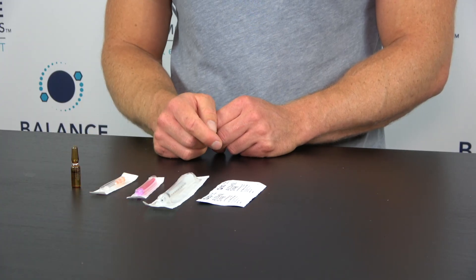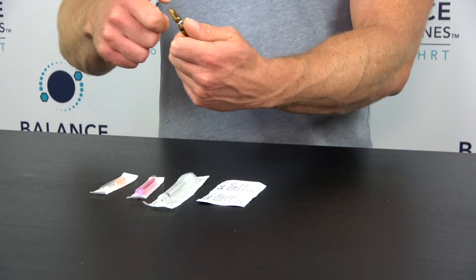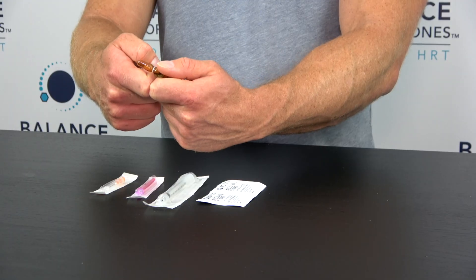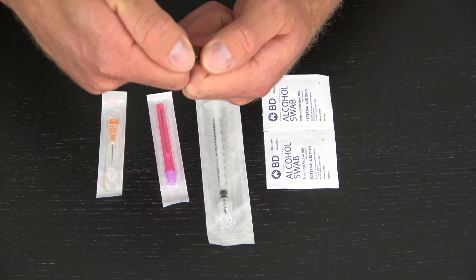First thing we're going to do is open the ampoule. There are a few videos on it — I think of it like a Kit Kat. You put your fingers together like this and put your thumbs on top, and the action is breaking it like you're snapping off part of a Kit Kat.